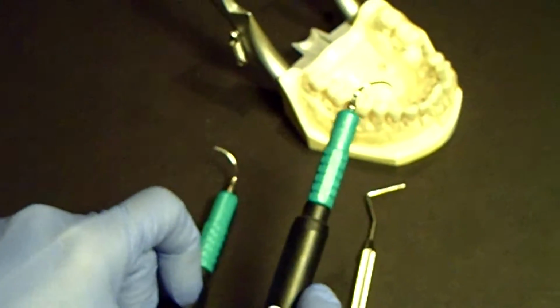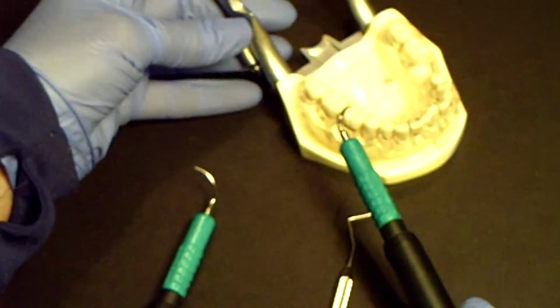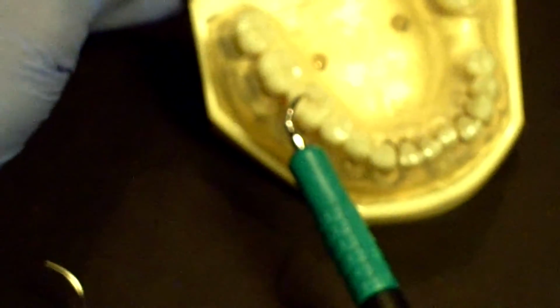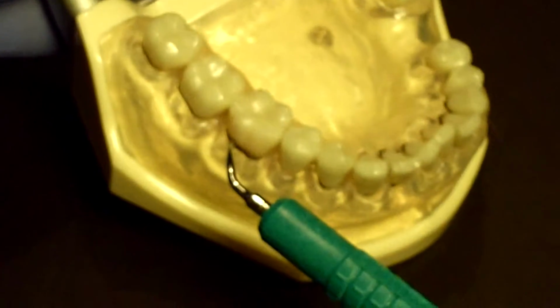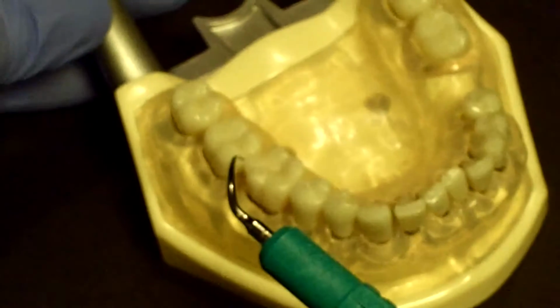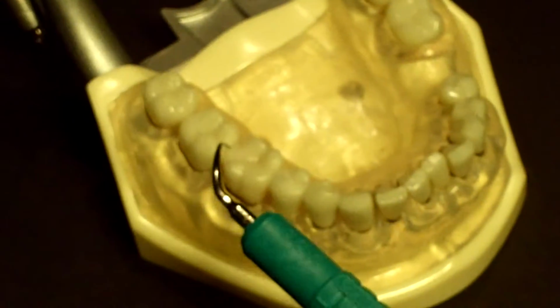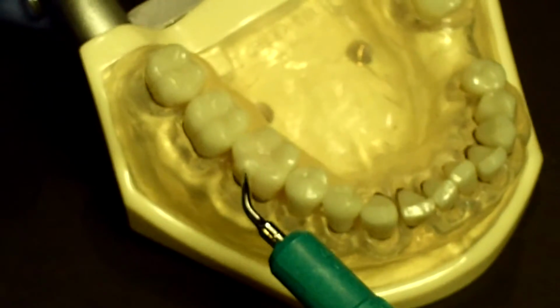We'll take the right insert, and if we place the right insert on the occlusal of tooth number 30 or 4-6, we can see that it curves to the right. With that, we know that we're going to enter into the periodontal pocket on the buccal, because the back of the insert, or the bump or the curvature to the right, is what is against the tooth upon entry.